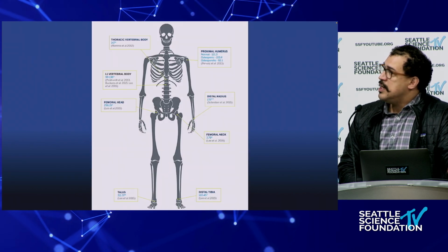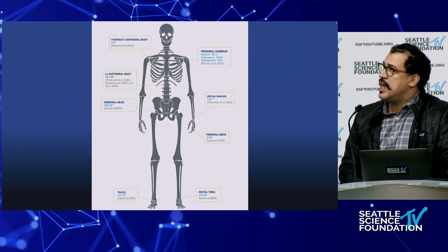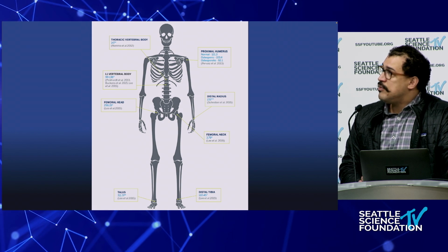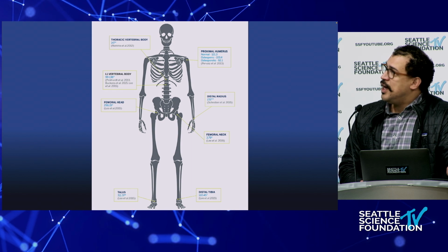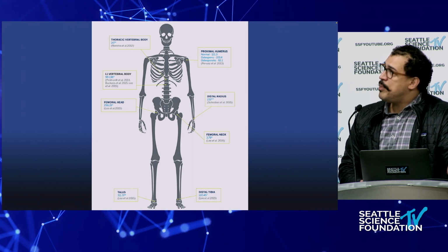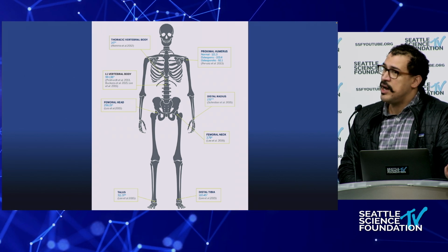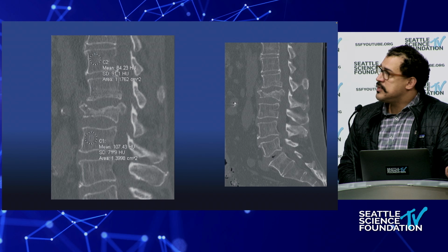It's important to know the standardization is at the L1 vertebral body, so if that level is not fractured, that's where the references are. You can see there, I would go to that top box, the average for a thoracic level is significantly higher, so know where you are when you're using these measurements.